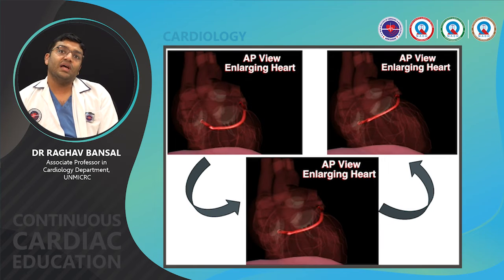This is an example of what happens, in the AP view. When the heart starts enlarging, it keeps on enlarging.